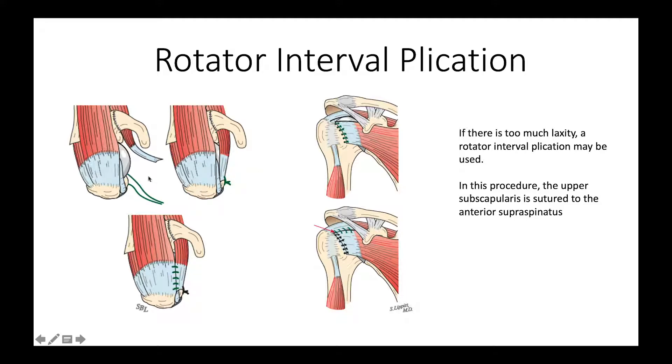In this situation, we simply close the upper subscapularis to the anterior supraspinatus using often four or five sutures, as shown here from the top and here from the front. The more of these sutures that are put in place and the closer they are to the coracoid, the more stabilizing the plication is. This is a nice technique at the end of the case where we can snug up a shoulder that looks a little too loose.